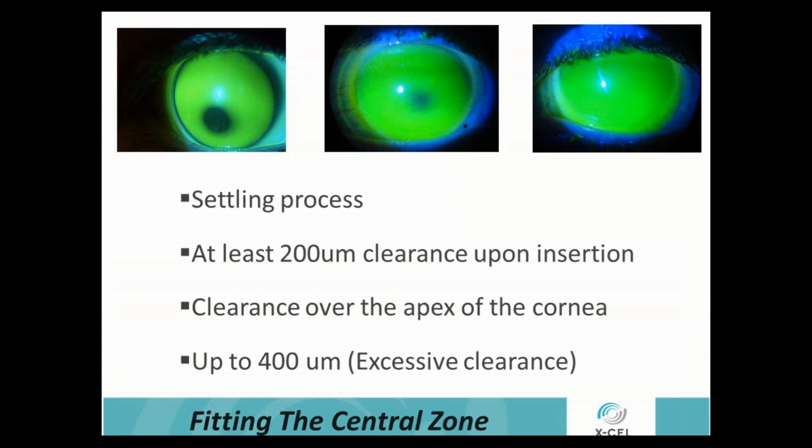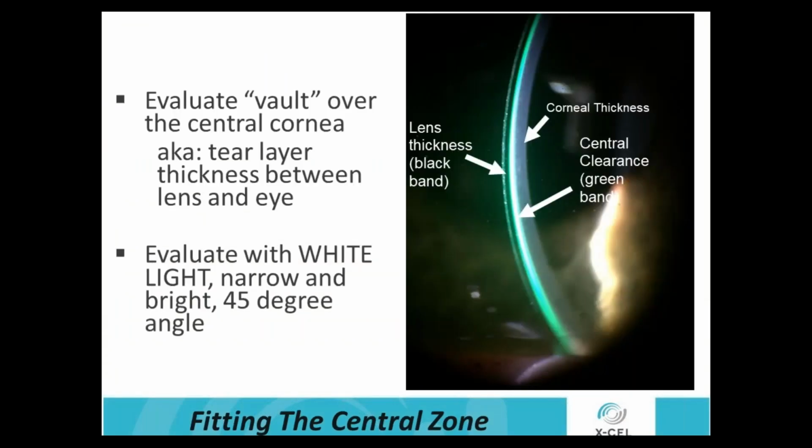All right, and going back to the over refraction or good endpoint on the over refraction, sometimes we see crazy amounts of astigmatism or over refraction still because there is too much fluid behind there. So look at your clearance, know that you're going to get some settling, and do your over refraction to determine if you have too much clearance. And comfort's going to be part of that too. I'm consistently asking the patient about comfort, especially upon insertion. I want to know exactly if they have any discomfort and where they have that discomfort.